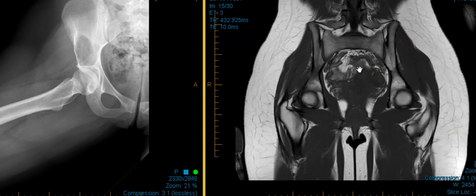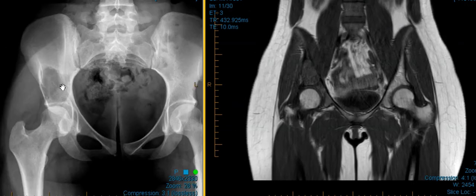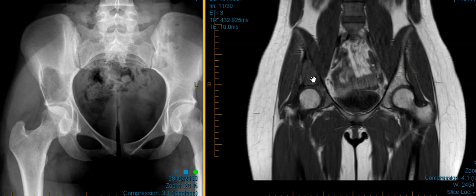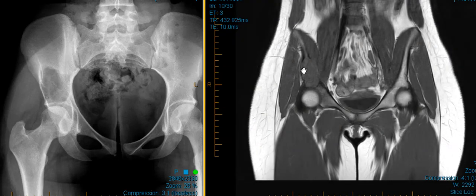So we did an MRI to look at this better, and we see that on this view there is a large bone lesion here. It looks expansile — instead of being a nice narrow width tapering nicely, we see this is abnormal in signal. It should be bright; instead it's dark. And we see it's wide, so it's expansile. So we have an expansile bone lesion in the right ilium here.